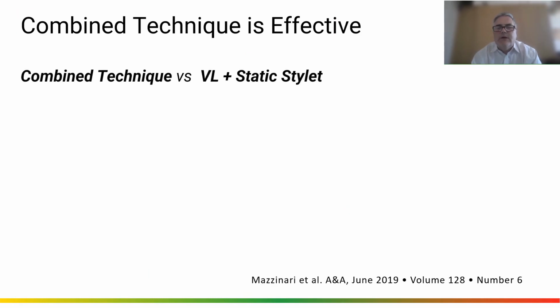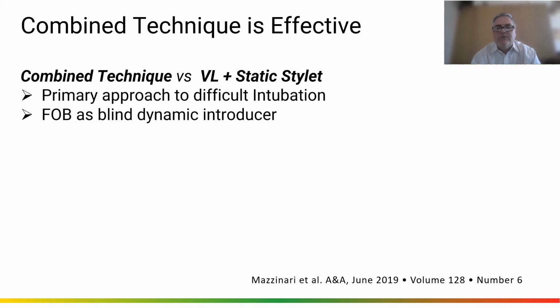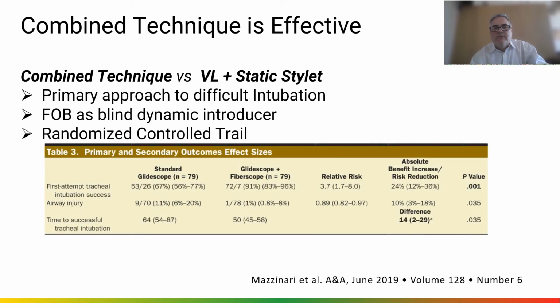This is a randomized controlled trial comparing video laryngoscope with a rigid stylet versus video laryngoscope with a dynamic stylet. Primary approach to difficult intubations. The fiber optic bronch was used as a blind dynamic introducer in this case. Randomized controlled trial, first attempt intubation success: 67% with a rigid stylet, 91% with a dynamic introducer.